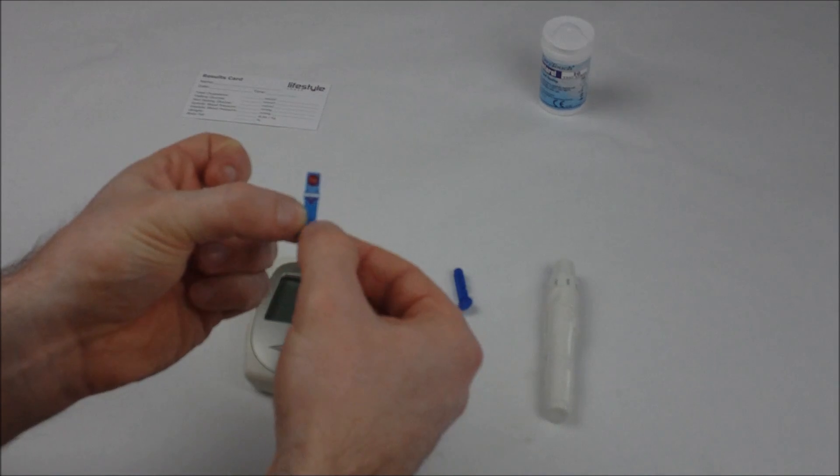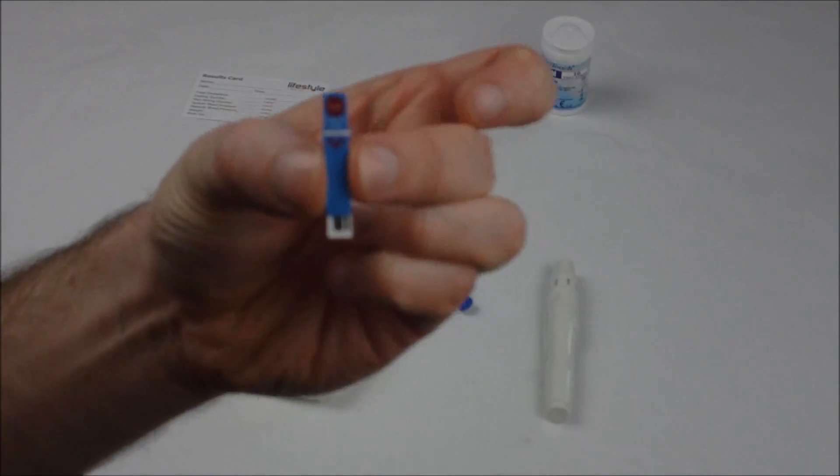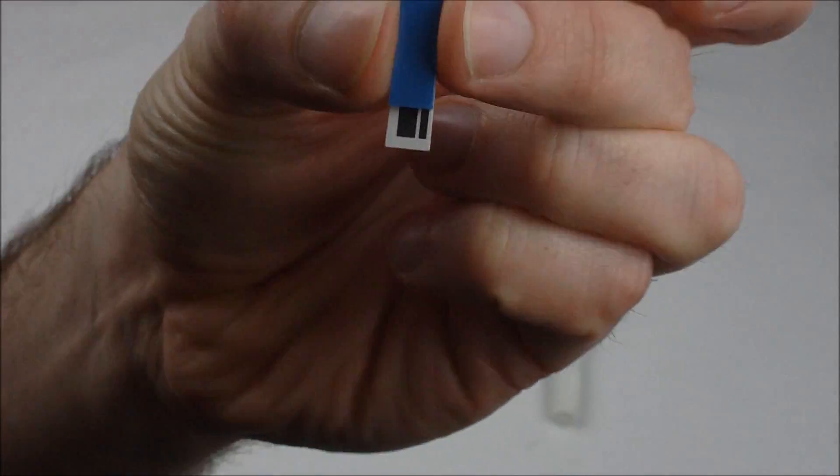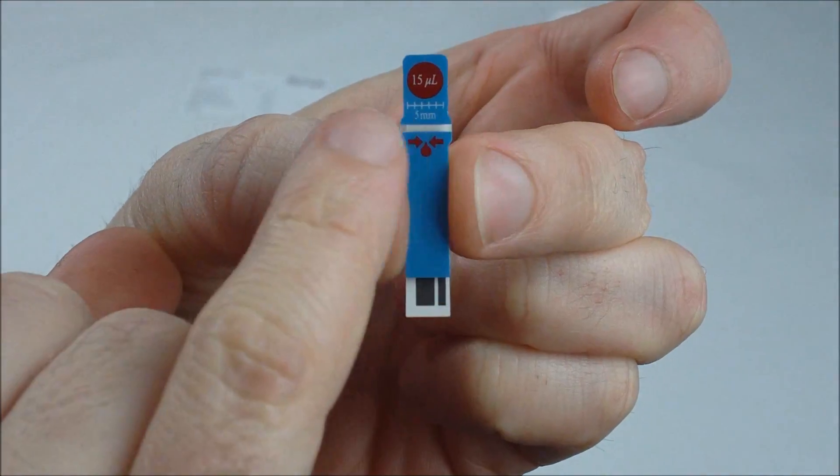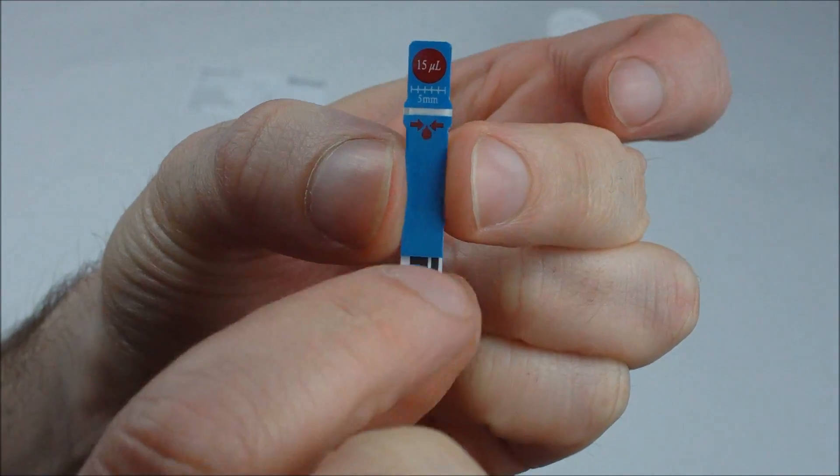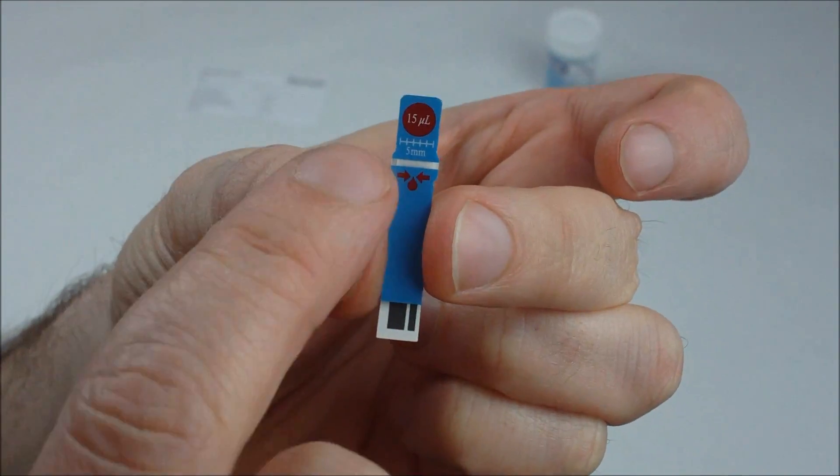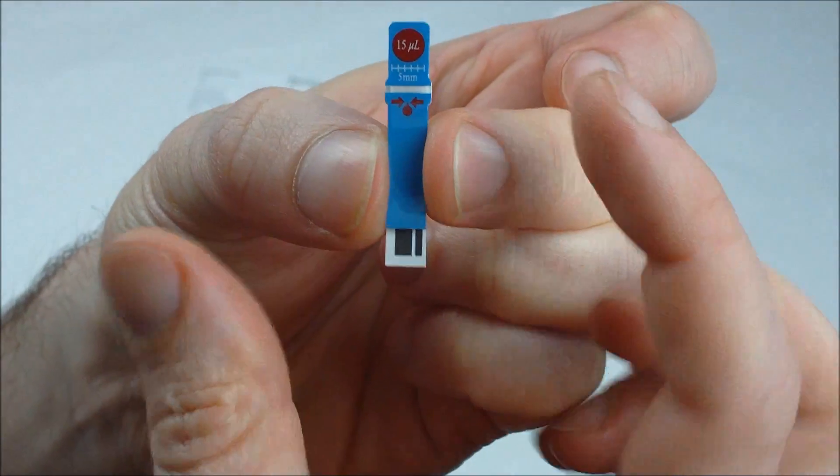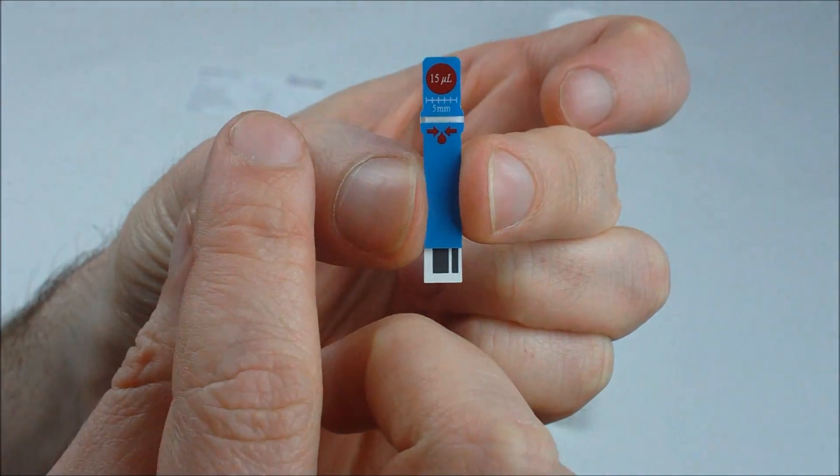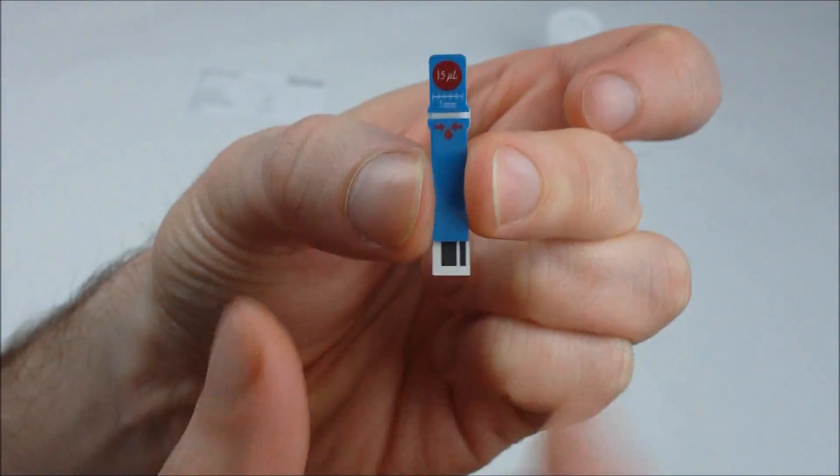Taking a look at the test strip for cholesterol, you'll see that it has a barcode area at the bottom and a test strip area along the middle, and you'll see two arrows from either side. So it doesn't matter with the cholesterol test strip which side you allow your blood sample to soak through.